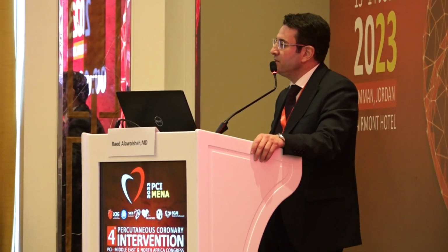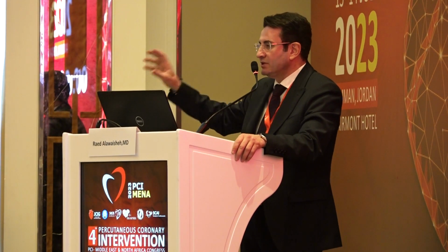I have learned this from Werner and from Maximiliano. They used to do this, and it is actually very safe, provided you are sure that the wire is in the subintimal space and your stent is not in the true lumen.